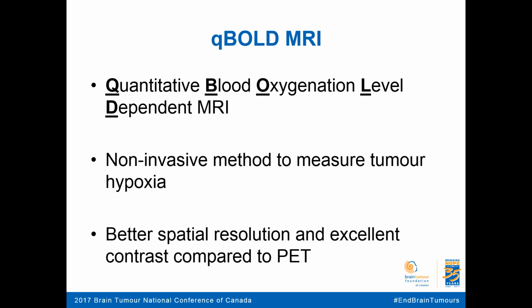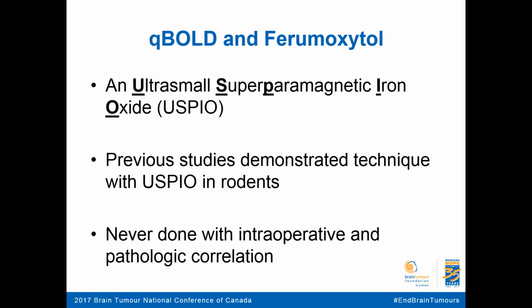They have a very short half-life, and it's technically impossible to do on a larger scale in clinical practice. But you have MRI everywhere, so if you can do this, you can do it on every single MRI scanner. And our point was to find a technique that you can do on any MRI.